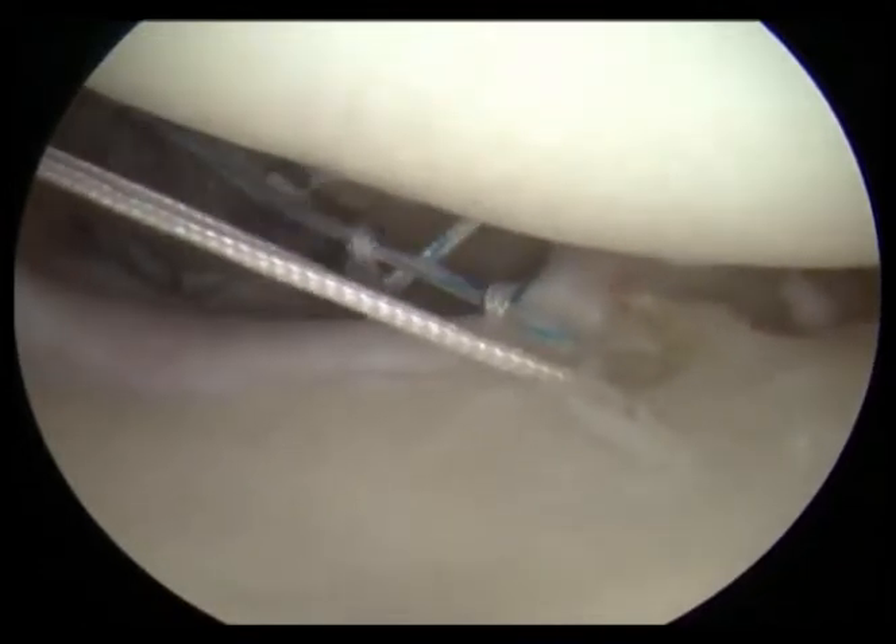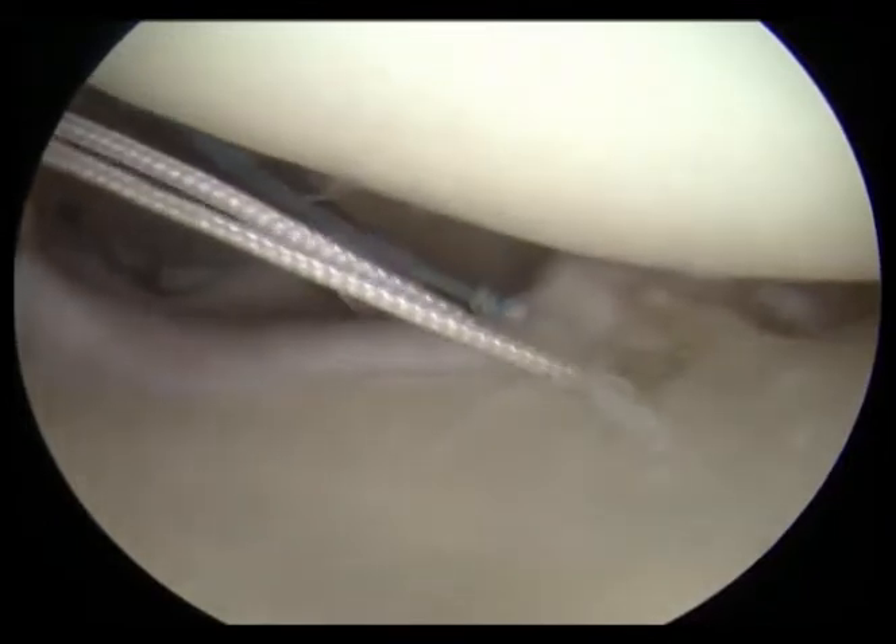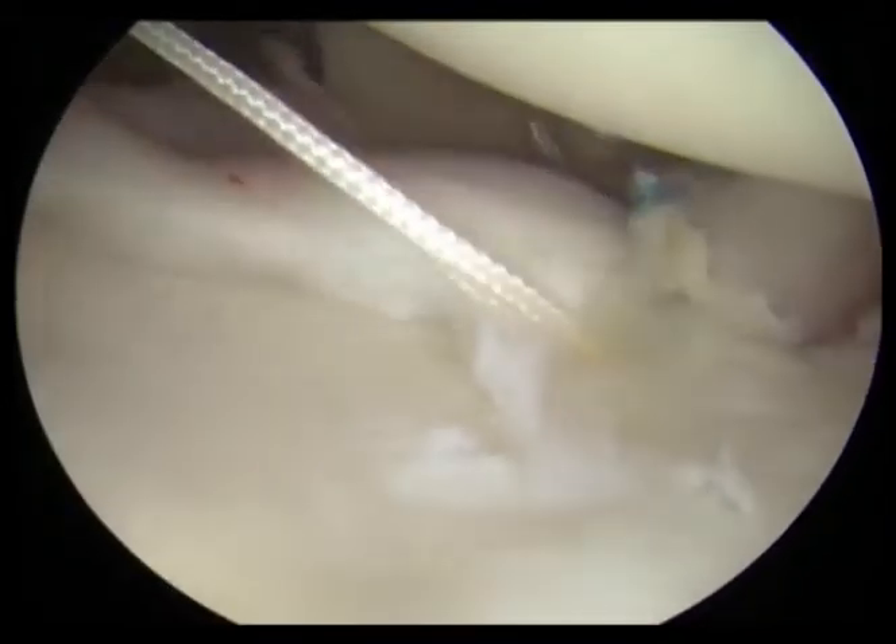Here we are tying some knots, and you can see we're doing this all through the scope — all arthroscopically — and you can see how we're able to pull the labrum back up.